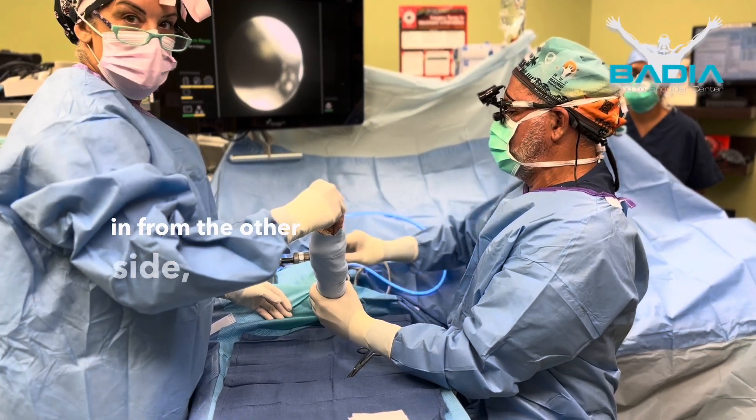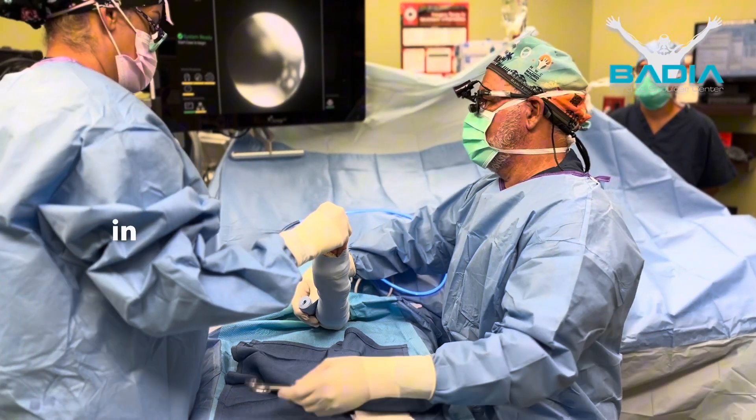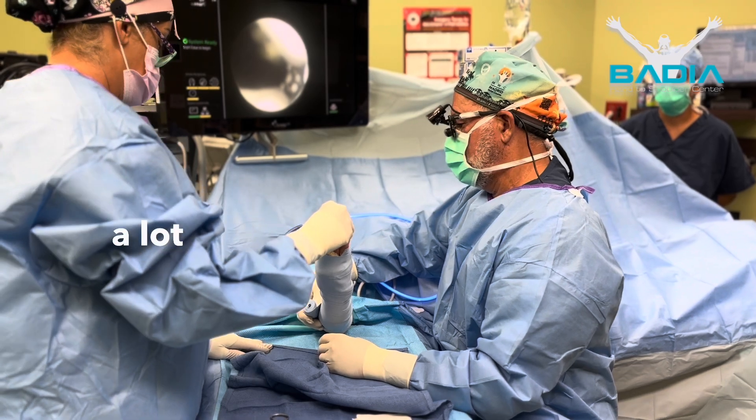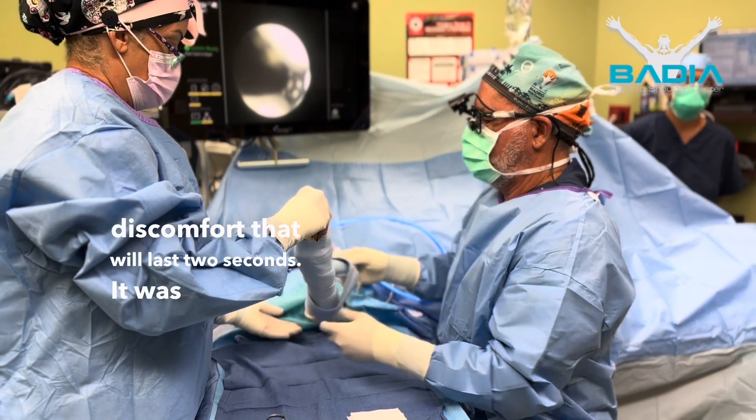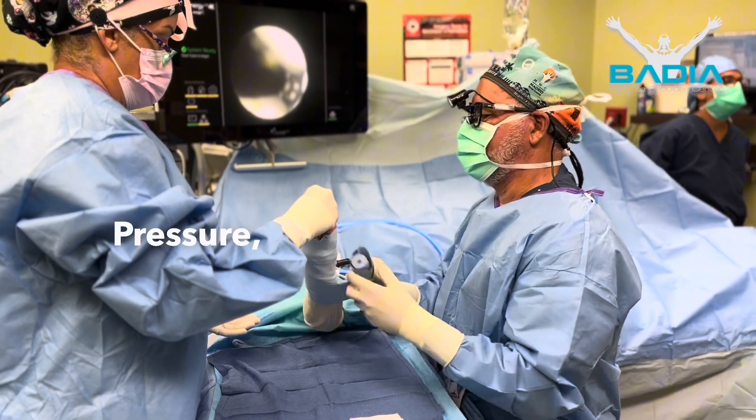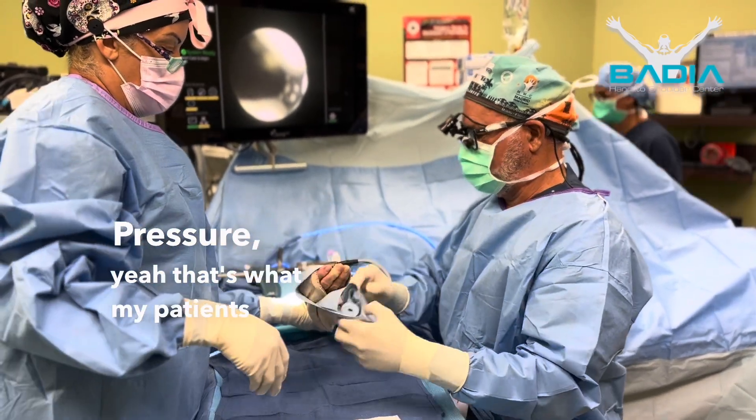Once I go in from the other side, if you remember, when I go in and cut the ligament, a lot of times you'll feel a little bit of discomfort in that last two seconds. It was more like a pressure — yeah, that's more like what the patient said.